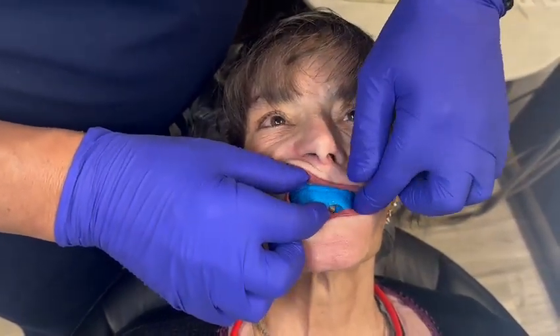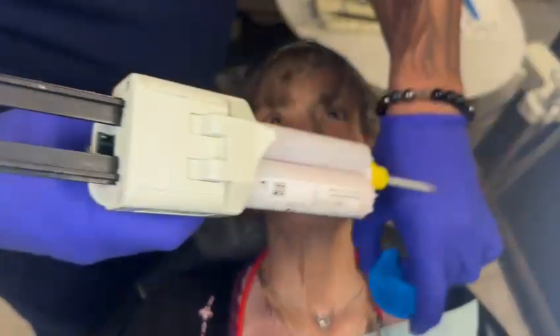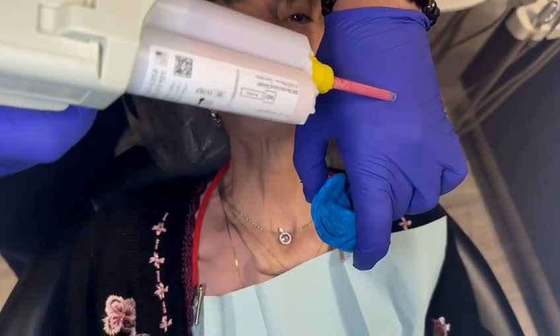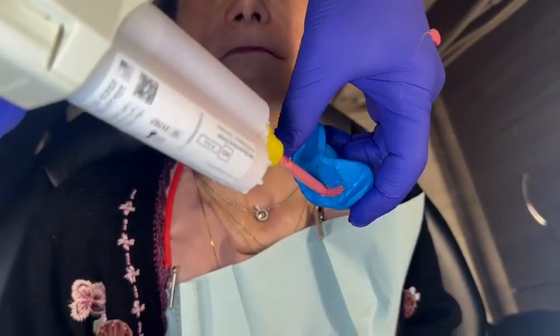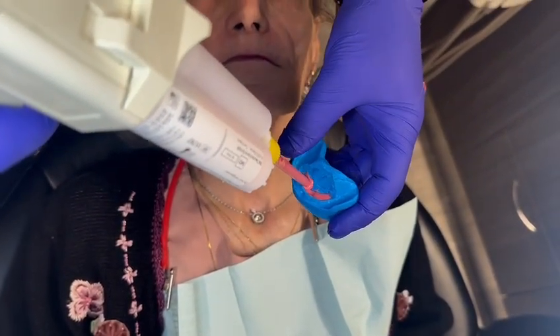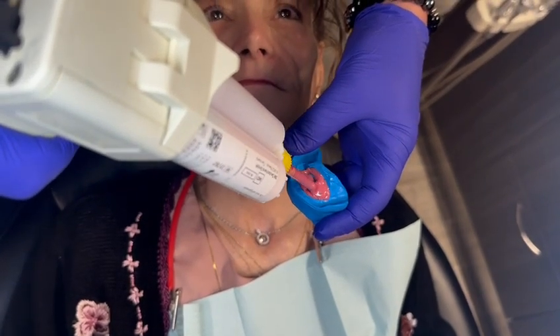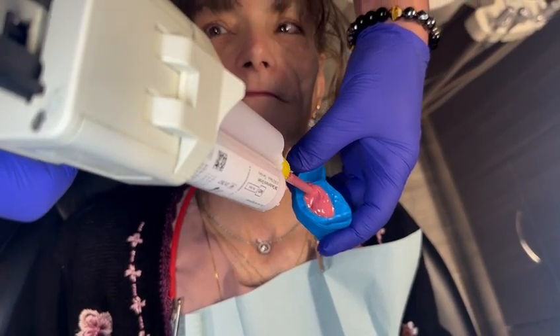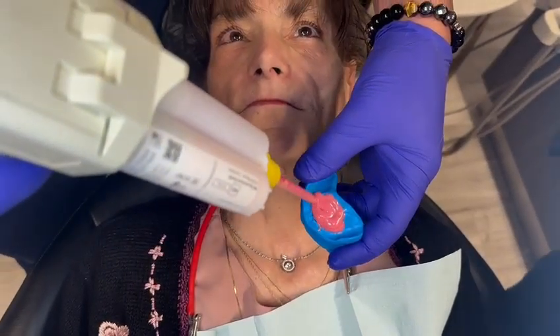Now we're going to add a little bit of light body to this so that we can get good detail of these rugae to align to. Because the putty, of course, doesn't give good detail. Now I've cut undercuts into here to hold the light body in.